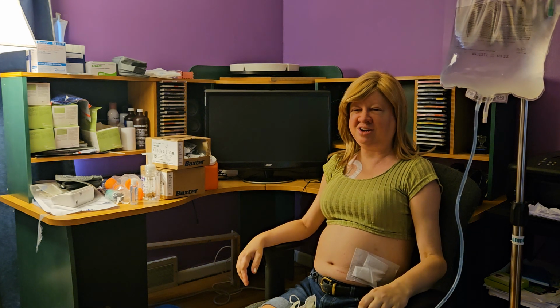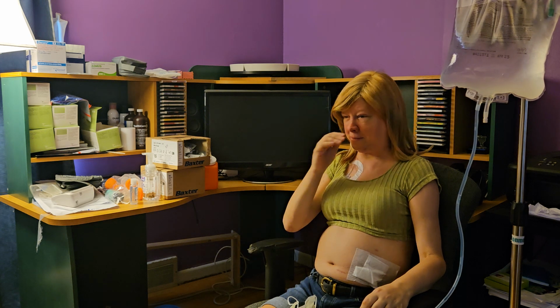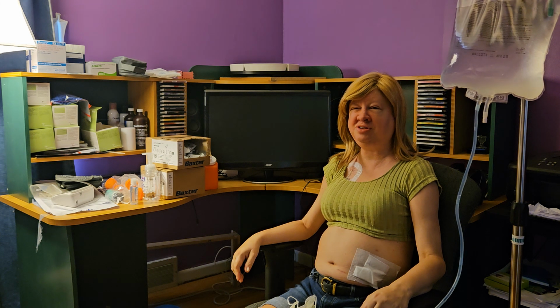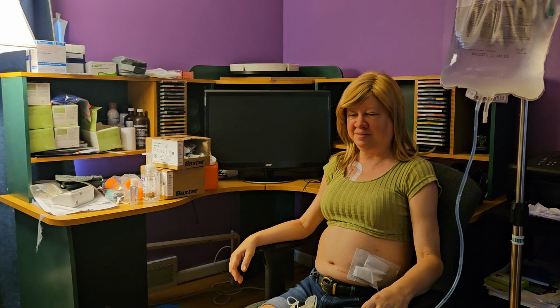Green is just a higher strength solution, so it would pull more fluid out. If you have high blood pressure, it means you have more fluid and it needs to come out. So you use a higher strength solution. Yellow is the weaker one. My blood pressure wasn't that high earlier, so now I'm using yellow for the rest of the day. Maybe this four times a day, every 4 hours.